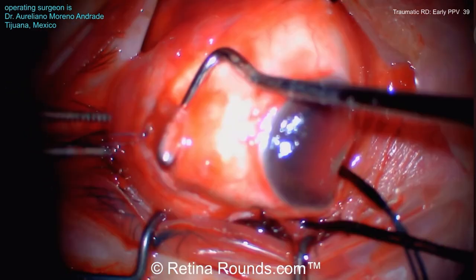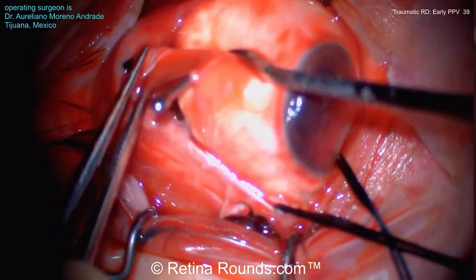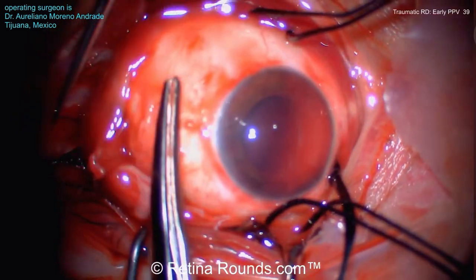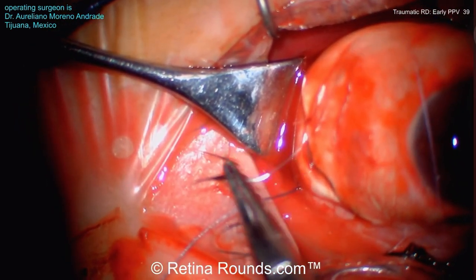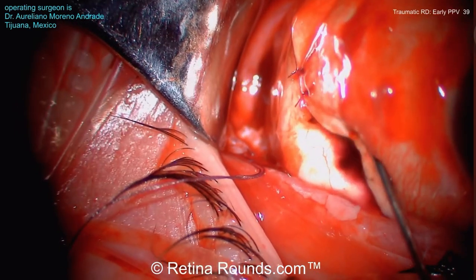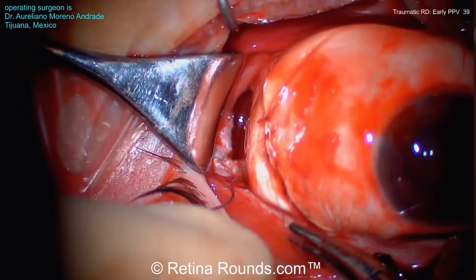Now, to gain access to the full extent of this rupture site, it looks like Dr. Andrade is now taking down the lateral rectus muscle, which is a really good idea to gain good exposure. It's going to help to decrease the amount of tension, the amount of manipulation of the globe in order to get good visualization. That's going to help decrease any risk for further uveal or vitreous prolapse.